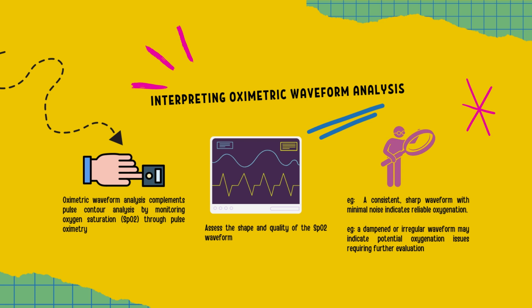We're not looking for dance moves here, we're watching for patterns. Imagine this waveform as a musical melody. Any deviation from the baseline melody can signal something important. For instance, if that familiar melody suddenly sounds a bit off-key or irregular, it's like a red flag waving.